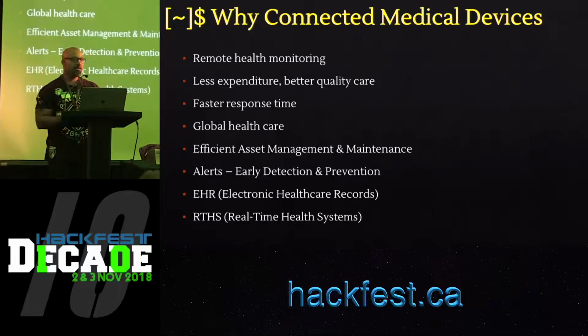We also noticed that as soon as it got connected to the network, it started to look for a pump server. And from our previous knowledge, we knew that infusion pumps usually talk to pump servers, so that confirmed what we already knew. But the problem was that we did not have a pump server in our lab.